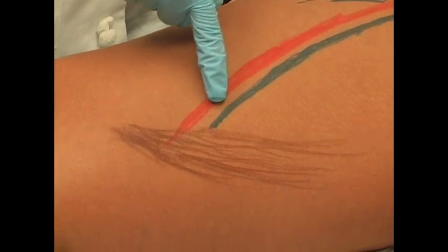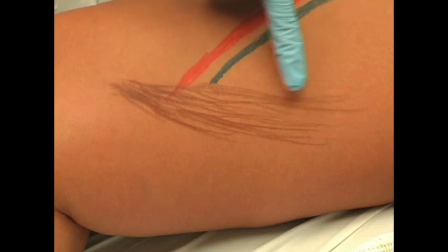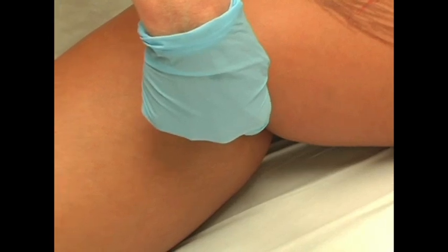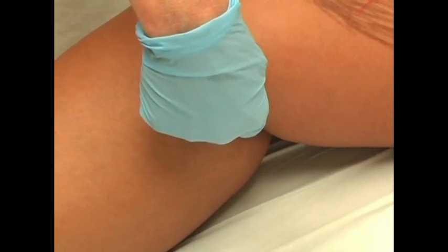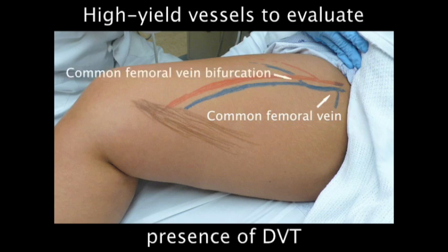Near the distal third portion of the thigh, the femoral vein runs posterior to the muscle and emerges in the posterior-medial aspect of the distal thigh as the popliteal vein. The popliteal vein continues beneath the joint and splits into 3 branches that do not need to be imaged in the emergency department. While some controversy from other imaging specialists exists, prospective studies direct focused, detailed imaging of high-yield vessels at specific locations to evaluate for the presence of DVT.